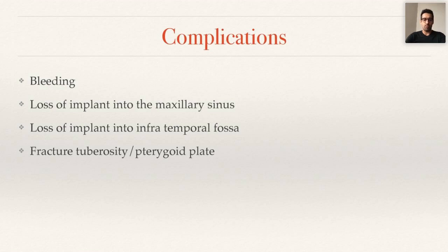Another complication, which has happened many a time to me, is that if you over-prep or under-prep and try to drive an implant in, or have misjudged your angulation, there's a real risk of fracturing the tuberosity or fracturing the plate off. There's really no harm if you pick that up. All you do is abandon the procedure, close up, and you can potentially go back to it at another date, or just leave it be. A fractured plate or fractured tuberosity, especially when I was initially learning this procedure, happened quite commonly.